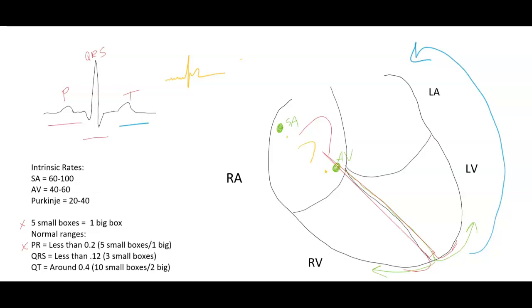So we know if the P waves don't look right and don't look good, there's something likely happening in the atria, okay? And in AFib, there's lots of little complexes kind of triggering, and the SA and AV node, they're all confused. They can't figure things out.